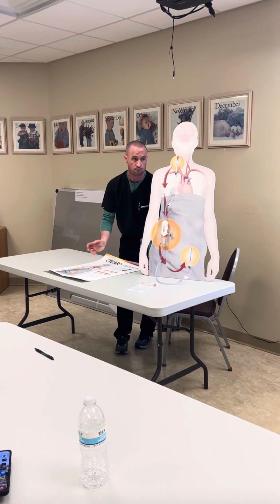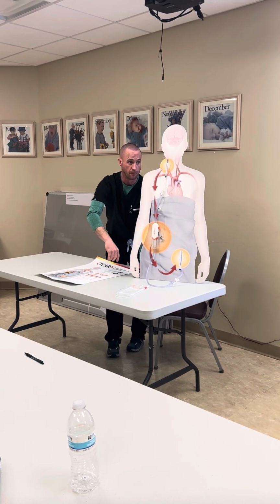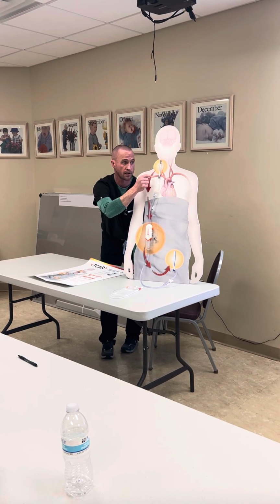And then once you've deployed the stent, everything is good. He's pulling wire, moving C-arm out, and then someone can hold pressure, pull sheath, and hold pressure here, and then he's closing the pocket, and then we're done.